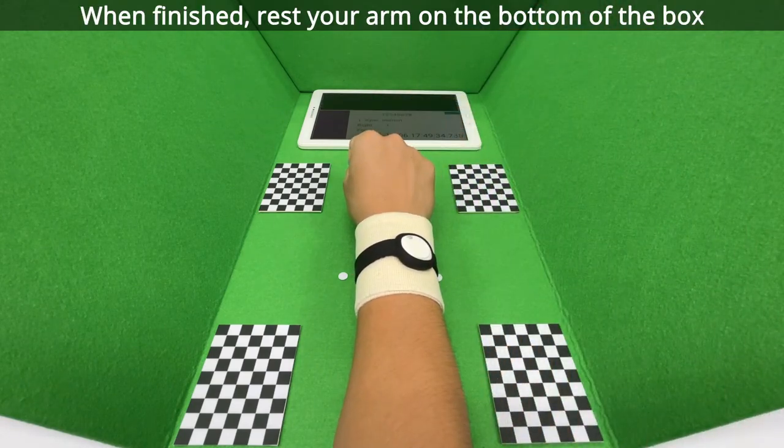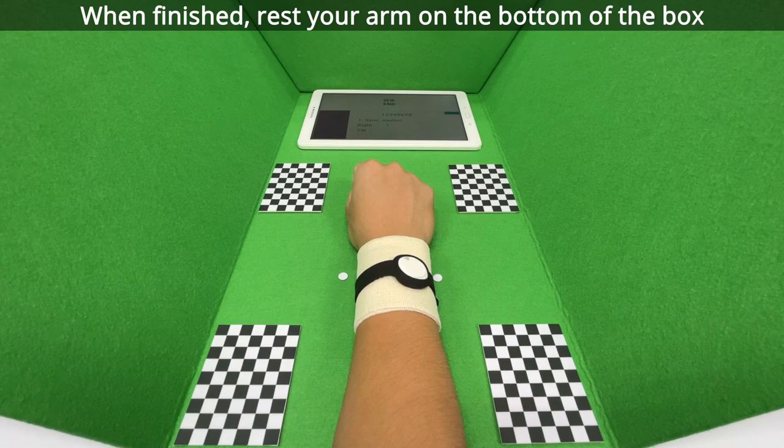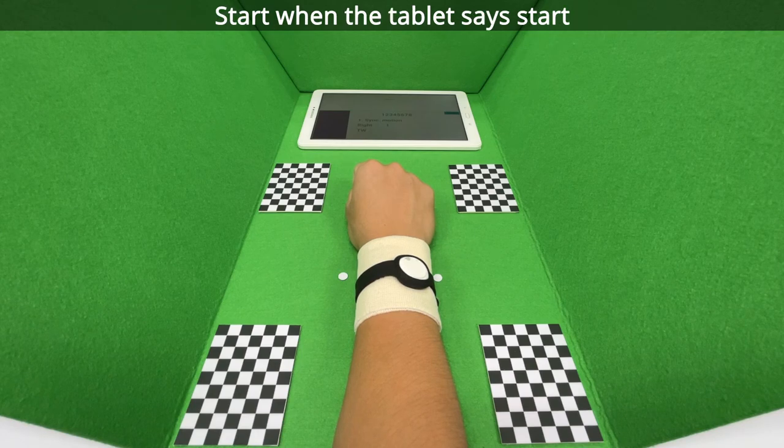When finished, rest your arm on the bottom of the box. Start when the tablet says start.